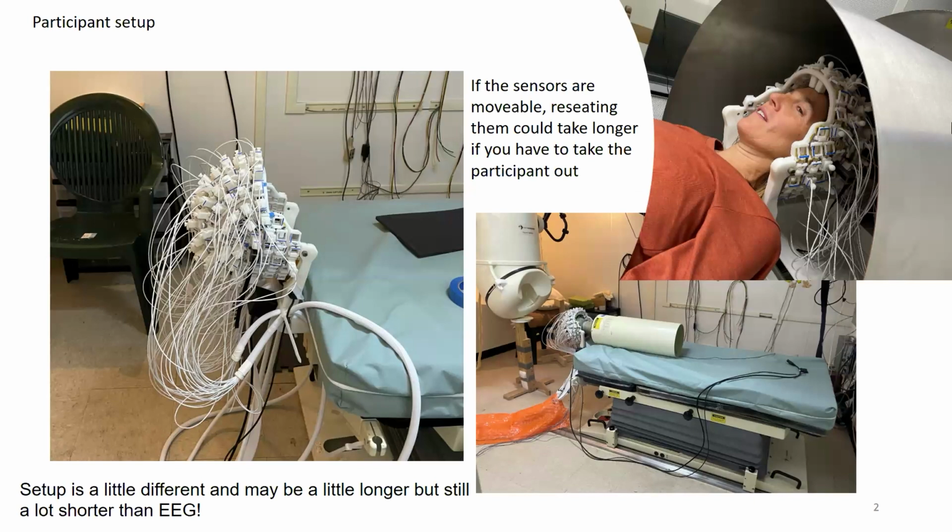To begin with, the setup is very, very similar, but a little different. But it's still a lot faster than EEG. Because these sensors are potentially mobile, and certainly you have to place them on the person and so on, the setup takes a little bit more time. And if you have sensors that actually touch the scalp, if you do something wrong, or if they need to leave and go to the bathroom, you have to pull them all out and put them all back in again, and that takes time. So that part is a little bit more onerous than SQUID, where you can just pull them out and so on. But in terms of collecting data, it's still way better than EEG.